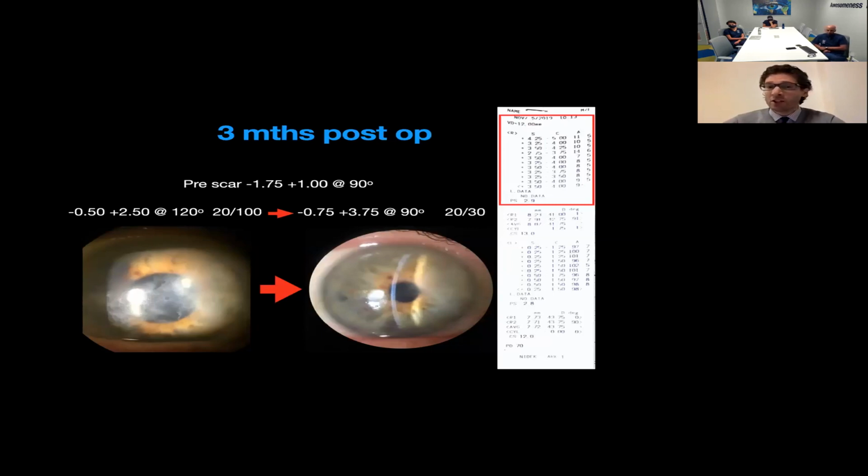I measure everything with an OCT before. And I know that the worst case would be for me to do less ablation than I have planned, because I am using actually the masking agent that will avoid some areas of ablation. So I actually go until the end.